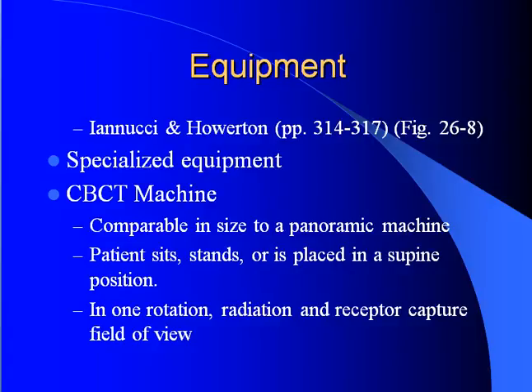CT scans require specialized equipment, or a CBCT machine. The radiation that exits the patient is received by a solid-state flat panel detector and becomes raw data that is sent to the computer. The number of manufacturers producing CBCT technology in dentistry is growing rapidly.